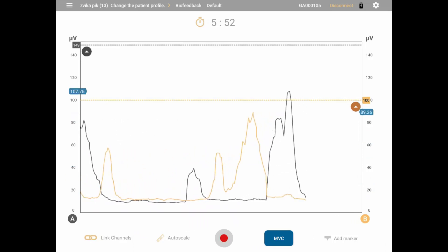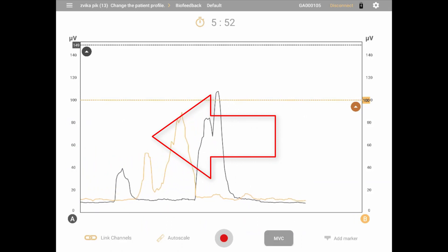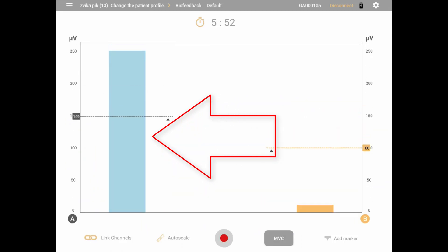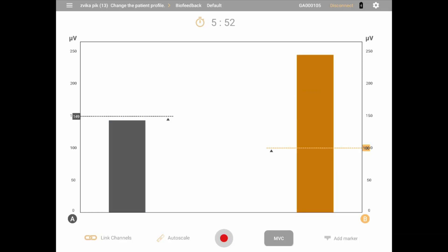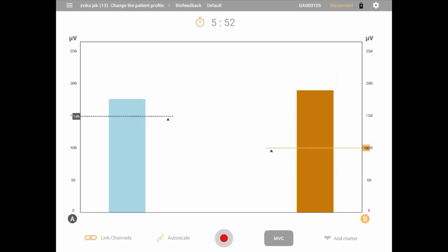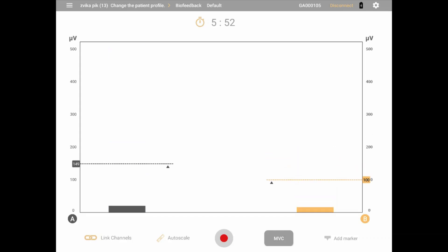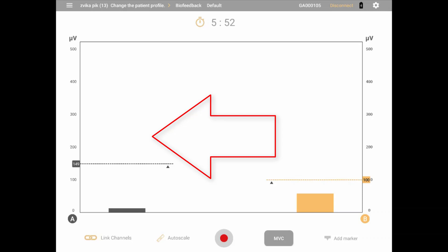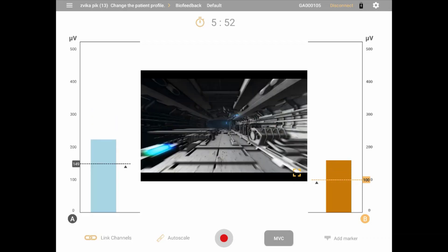Swipe left anywhere on the screen to switch to bar graph view, showing one or two signals with the y-axis only. All the same view settings are available in this screen except for x-axis scaling. Swipe left again to reach animation view, displaying bar graphs and an animation in the middle of the screen.